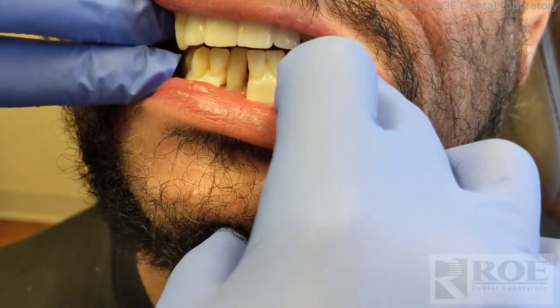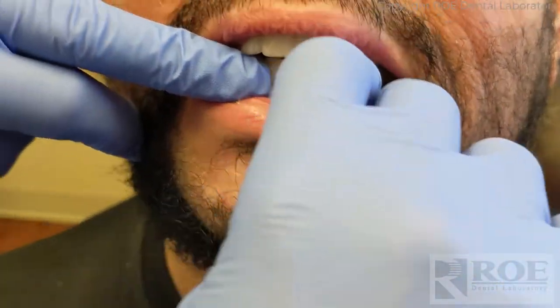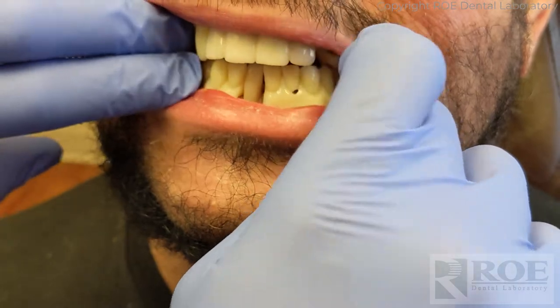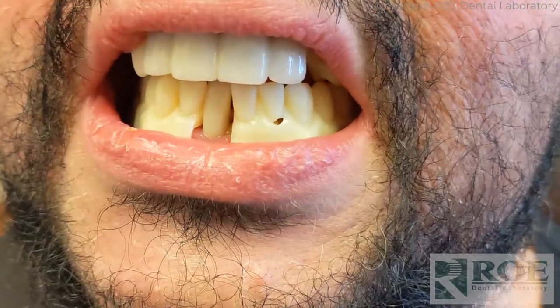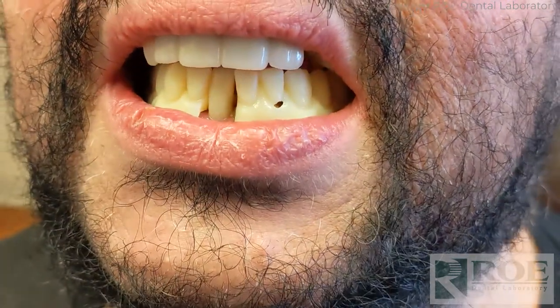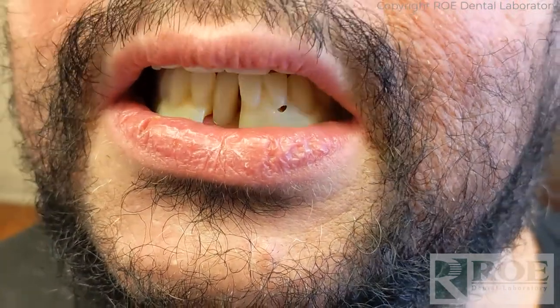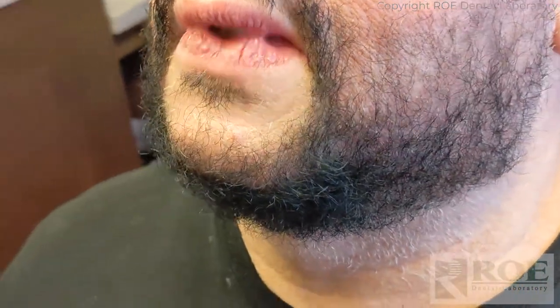Can you tell us if it's hitting in one area more than another? It's digging down here in the flange area. But check to make sure there's no rock — if you open a little bit, then close just a little bit, then bite down, does it feel like it's hitting pretty evenly everywhere in the teeth area? Okay, that's what we're looking for.